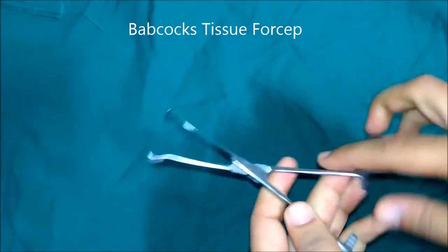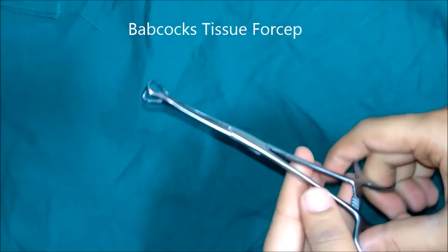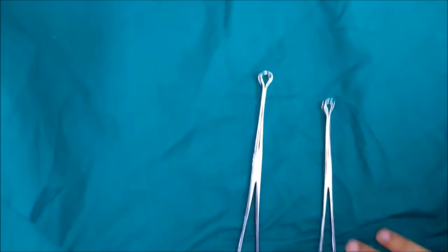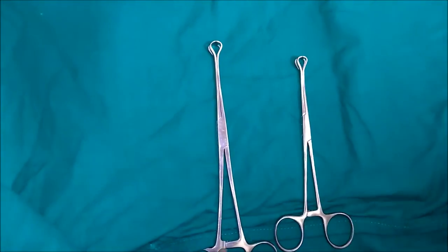This is Babcock's tissue forceps. The terminal part of the blades are curved and fenestrated. As there are no teeth on the terminal part, this is a non-traumatic forceps. It can be used to hold tubular structures like the fallopian tube, appendix, or ureter, or to hold the intestine or gallbladder.